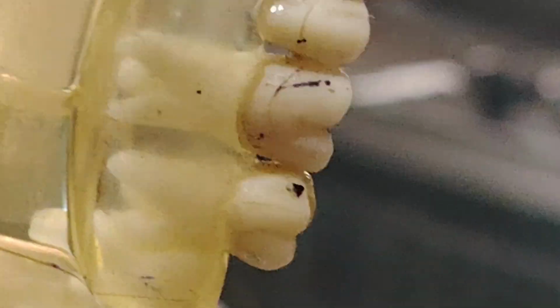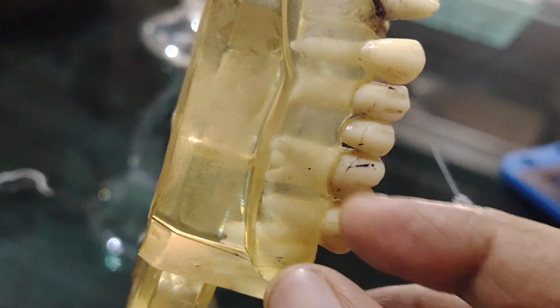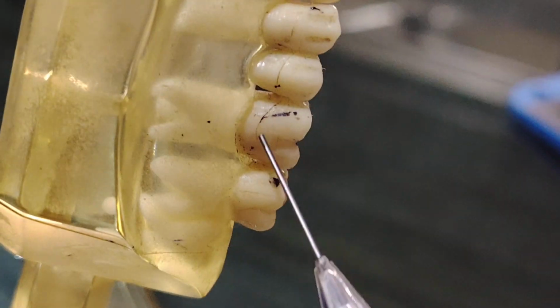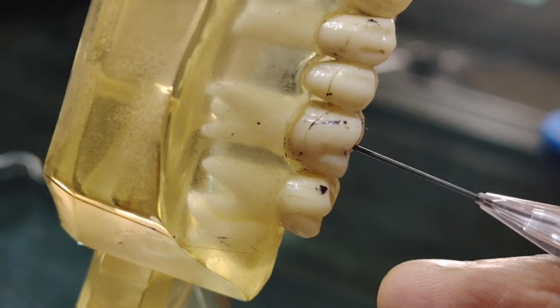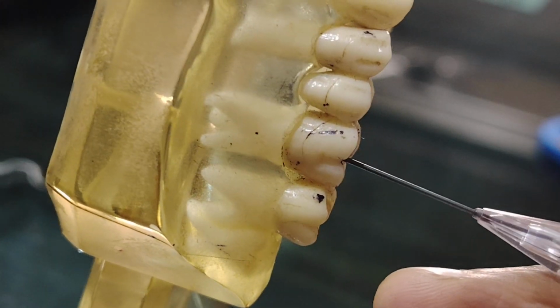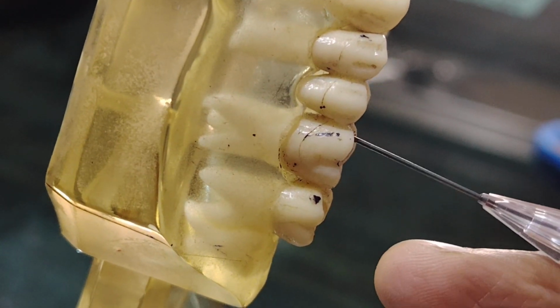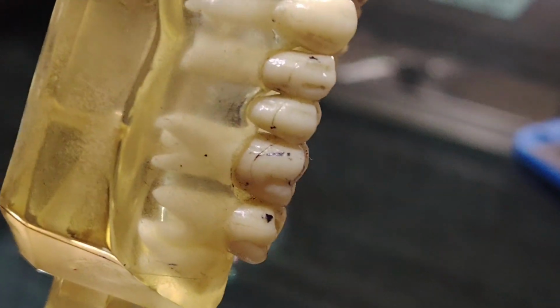How are we going to orient our bur? As you can see, this is the tooth, the first molar. This is the right side one I'm talking about right now. The bur is straight to the long axis of the tooth, and then I will make the necessary palatal, buccal and distal refinement, and that is how I will achieve my access opening.